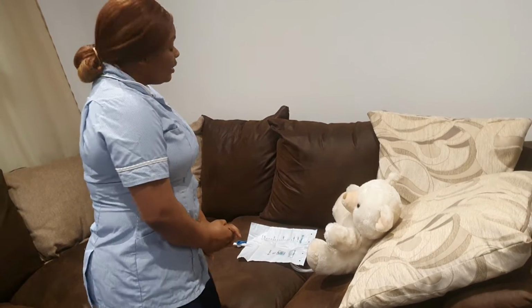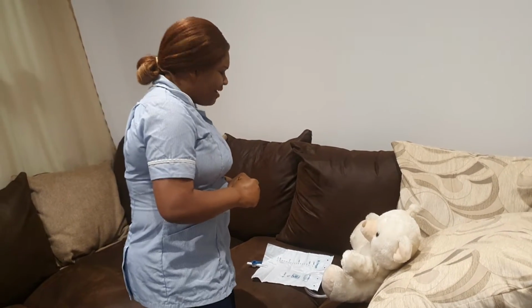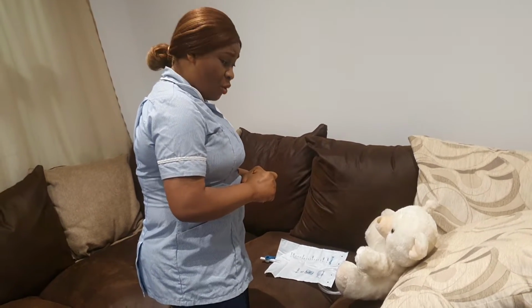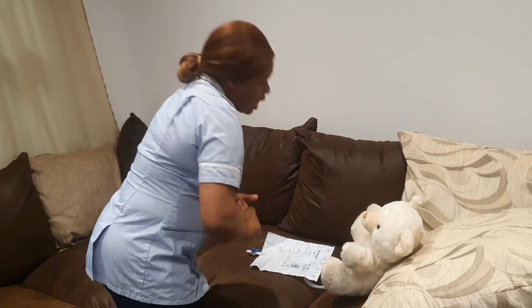So, Haley, the reason I'm here this morning is because I want to collect a sample of urine from your catheter. The doctors are happy for me to get a sample of urine from your catheter. Is this a convenient time, Miss Haley? Oh, bless you. It's a convenient time. Lovely. So, Haley, I'll just leave you with a call back while I assemble my equipment. Is that all right? Lovely.